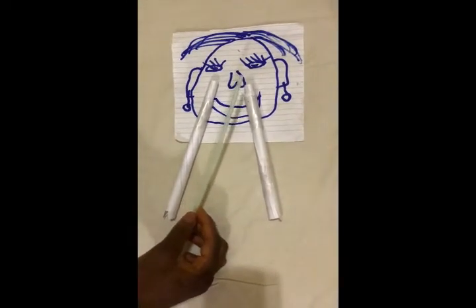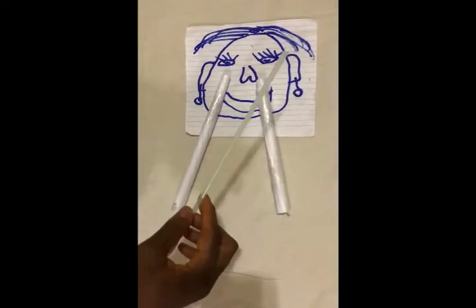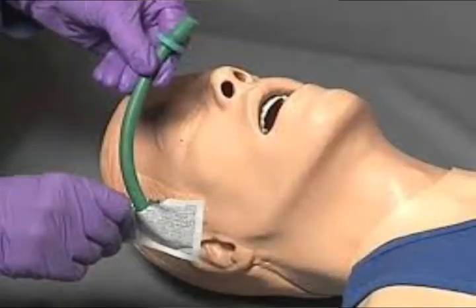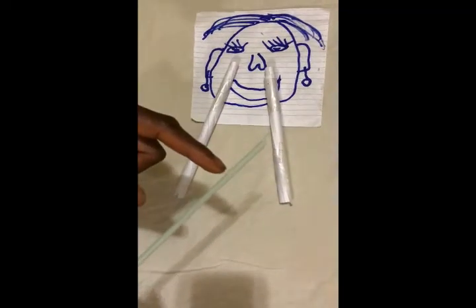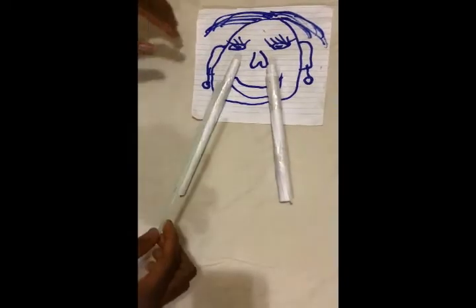After doing this, some people use water, while some people use a water-soluble lubricant, and you lubricate the distal surface, which is this part of the tube, and then you insert.